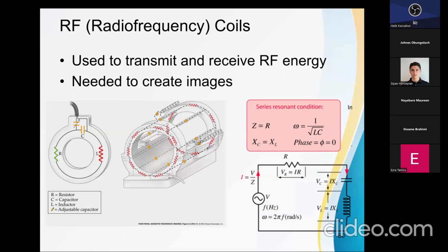Sometimes you might need to add some resistance in to try and match certain resistances. But you realize then that if you are to reduce the resistance, for instance, you might need to cut the length of the coil. If you are to reduce the inductance, you might need to remove a certain loop and either cut it off or make it straight. So this becomes very difficult for you to vary.